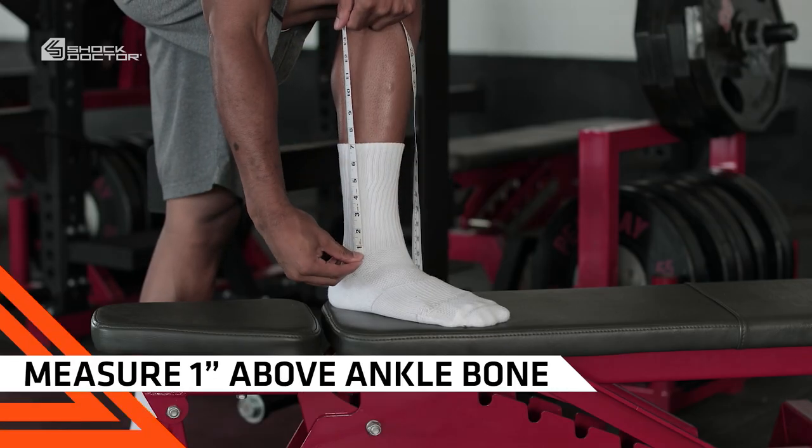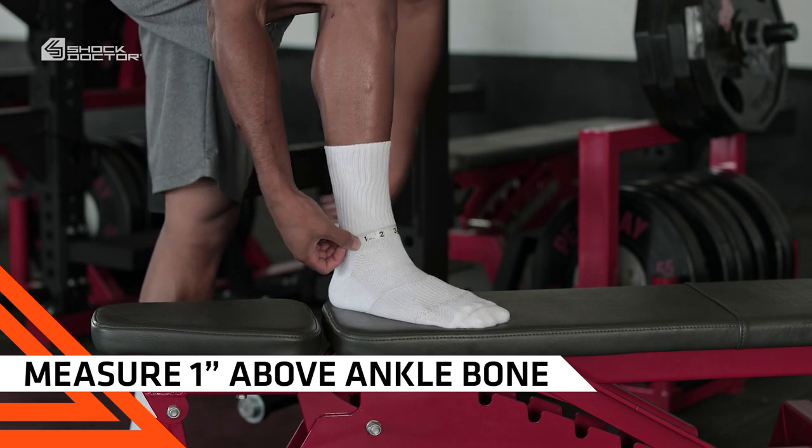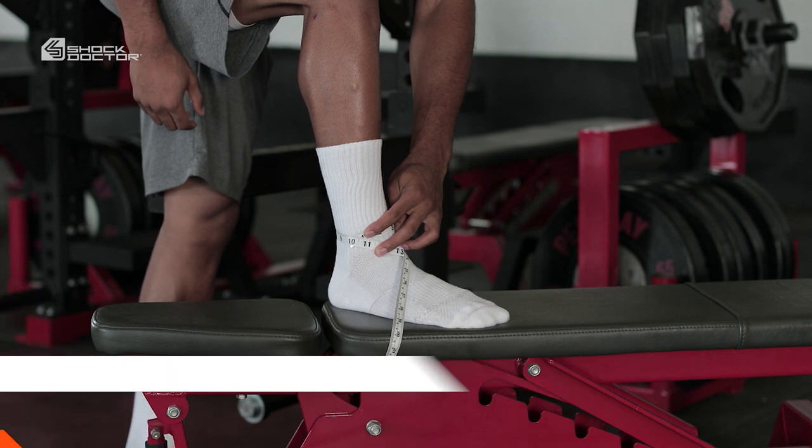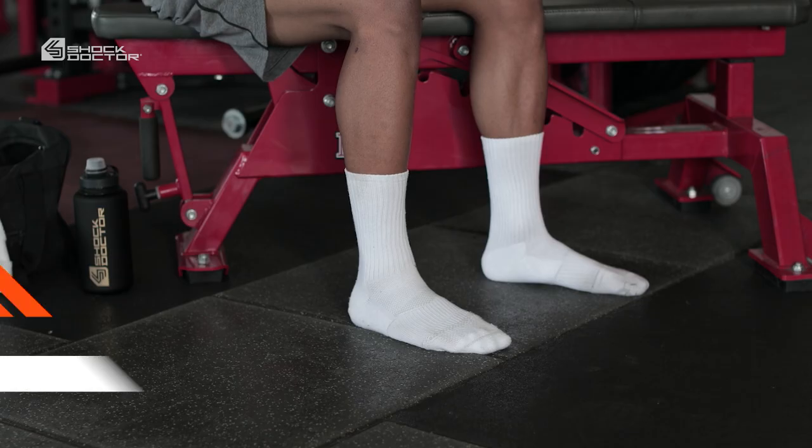Begin with fit. Measure your ankle approximately 1 inch above your ankle bone and select your size from our online and packaging size charts. If you're deciding between two sizes, select the larger option.